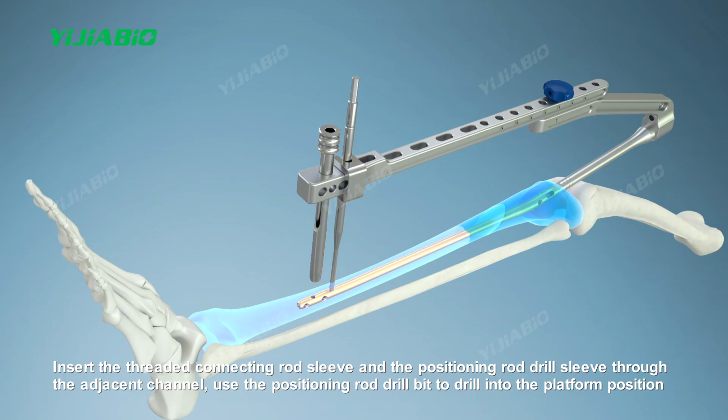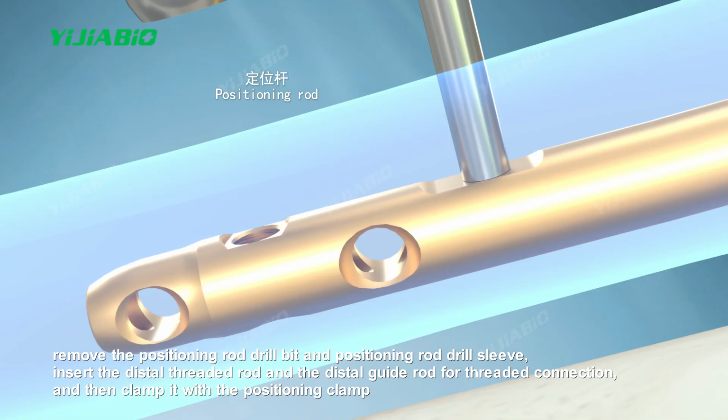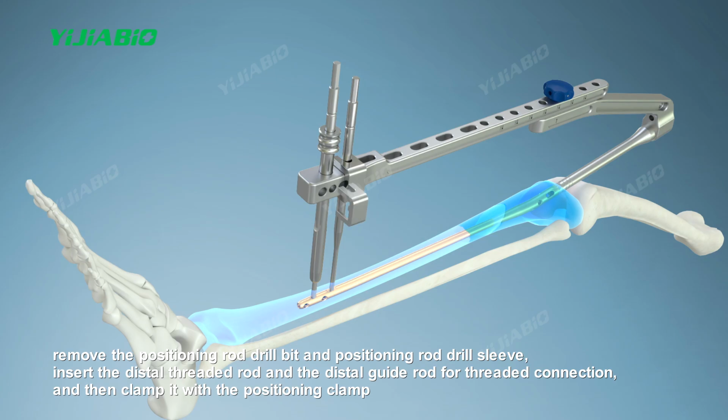Insert the threaded connecting rod sleeve and the positioning rod drill sleeve through the adjacent channel. Use the positioning rod drill bit to drill into the platform position. Remove the positioning rod drill bit and positioning rod drill sleeve. Insert the distal threaded rod and the distal guide rod for threaded connection, and then clamp it with the positioning clamp.